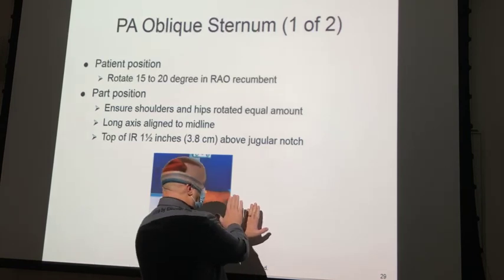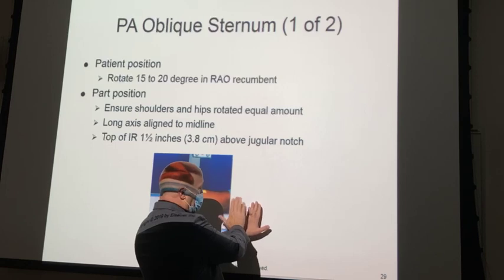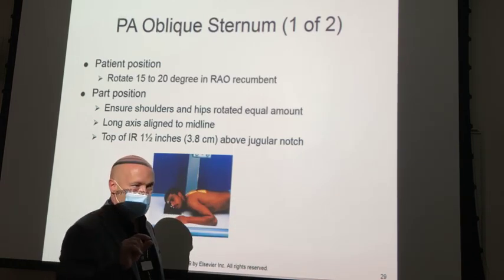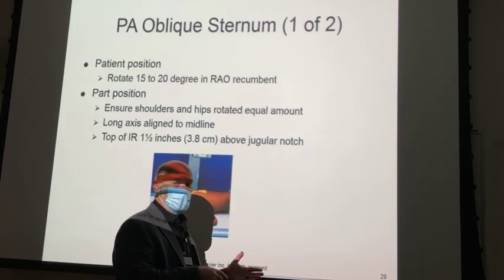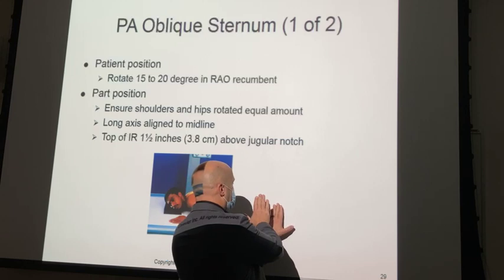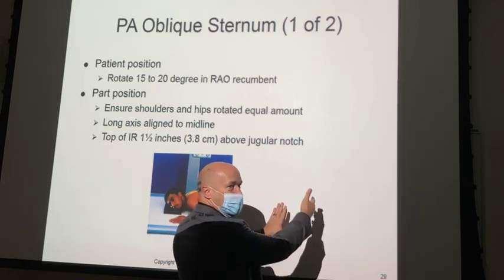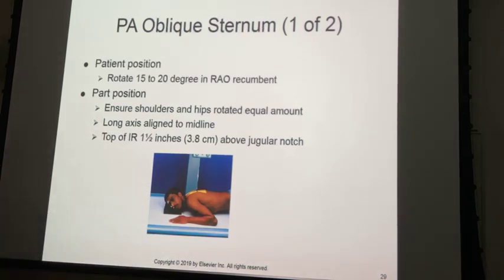All right, so we're going to use the RAO, and what that does is you've got your sternum here, and you've got your heart. Remember, your heart's at midline, but the biggest portion of the heart is towards the left-hand side, right? So the patient's lying on their stomach. The sternum is a very, very thin bone that's going to be difficult to visualize, so we're going to add the heart as if it was contrast. To increase the appearance of the density of the sternum, we're going to rotate the patient into RAO so that the shadow of the heart is projected over the sternum itself, just to add a consistent density as opposed to all those squiggly lines in the lung markings.